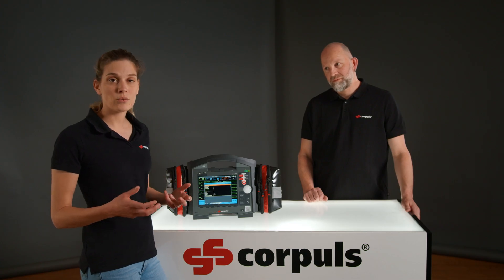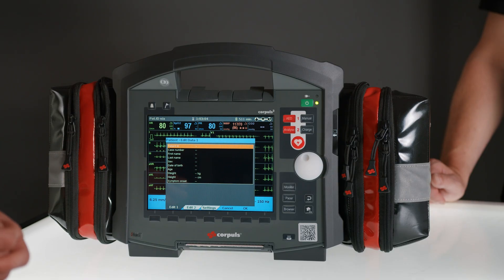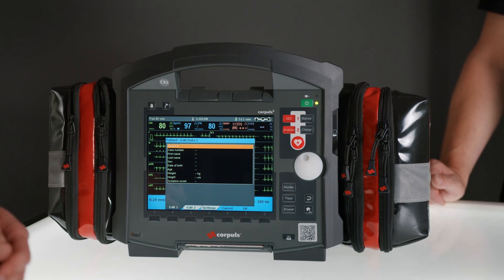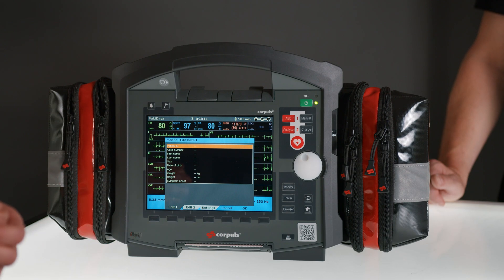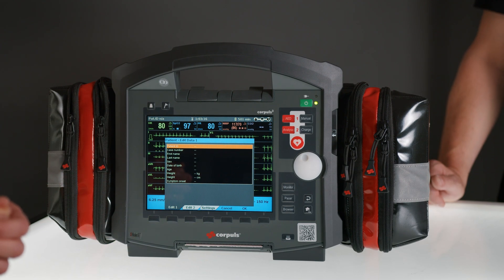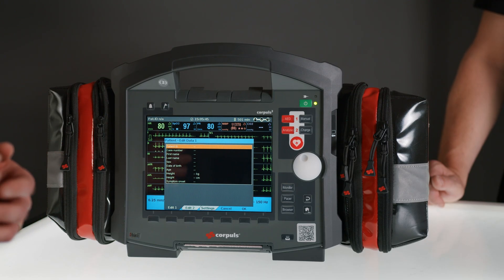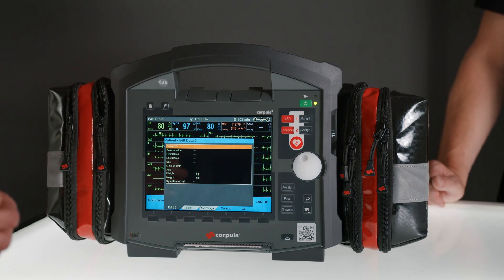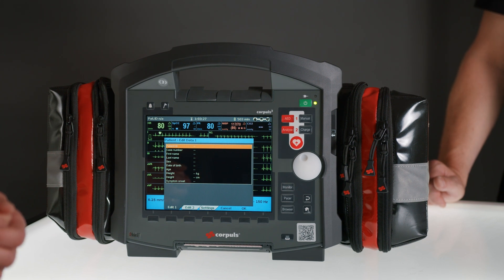The ECG is frozen at this point and the last 10 seconds are saved for interpretation. At the same time, the patient data input screen opens. If your Corpuls 3 has a card reader and you have already read the card, or everything has been read into a connected electronic patient documentation system, this data will be pre-filled. Otherwise, for a correct interpretation with the Glasgow algorithm, you must enter the patient's gender and age — the default is a 50-year-old male patient.